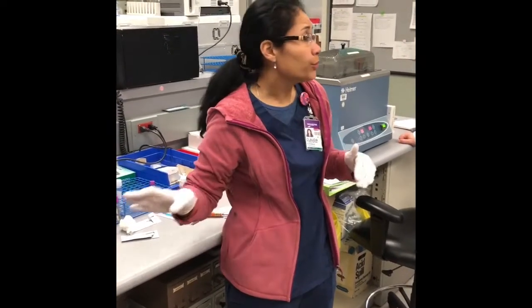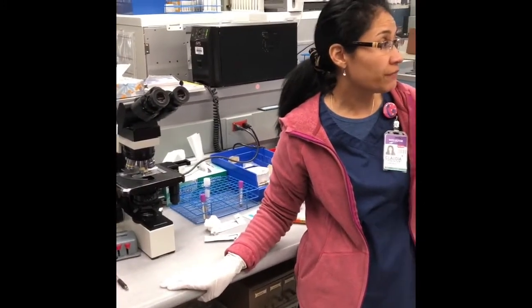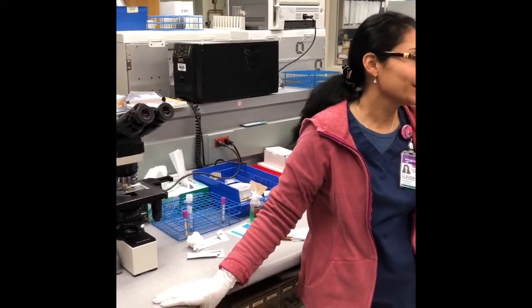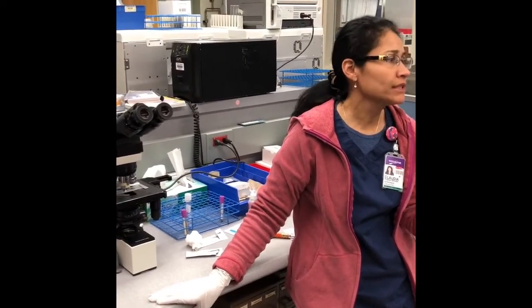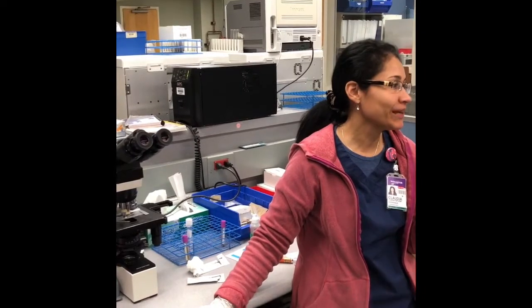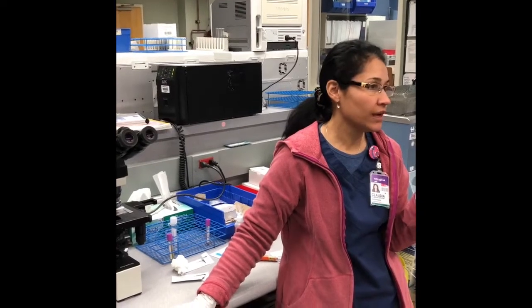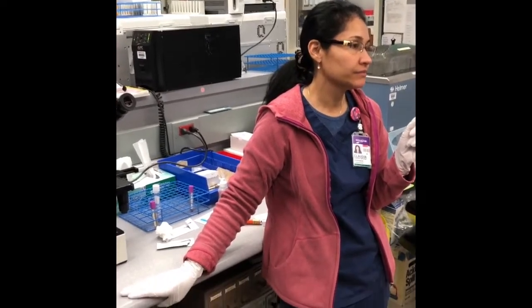We don't use it as often because we use the automated. And the rules also, when you're doing manual, are the same as if you're doing the iris. If you get less than 5 cells, don't bother to do the differential because you're going to get a crazy result of 100% lymphocytes with a total of 1 cell. So the rule is everything that is less than 5, just go ahead and hide it. You highlight it and do not do that. You don't want a total count of 2 or 3 and 100% lymphocytes. That would be crazy. Less than 5.